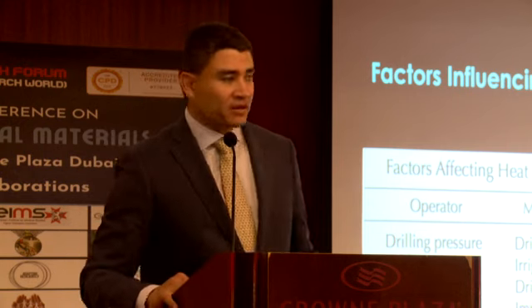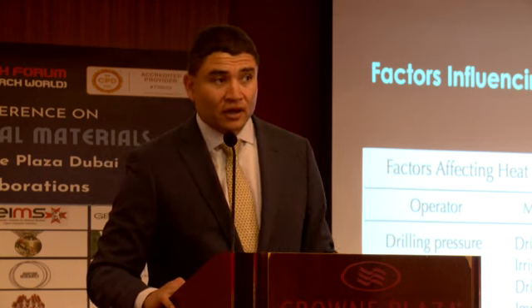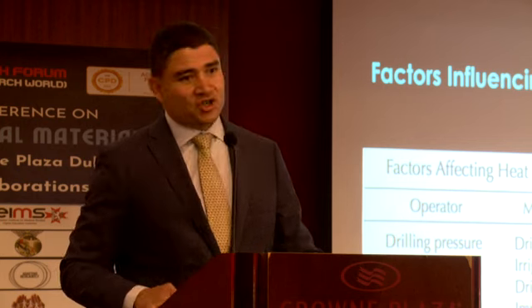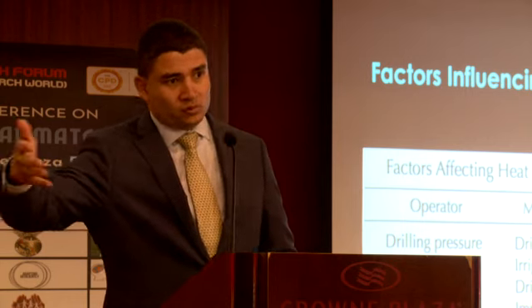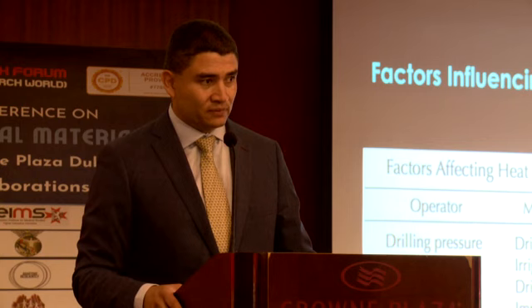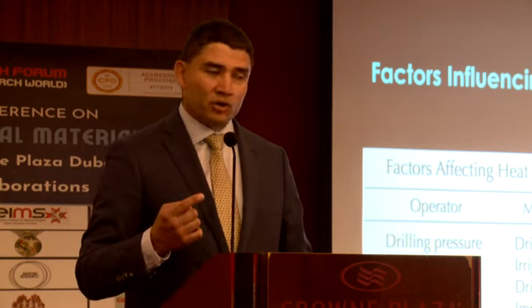The drill sharpness. Is my drill sharp or not? How many times have I used the drill? Oh, I'm a cheap dentist. I'm sorry, I haven't saved some money, right? I charge the patient an extra $2,000, $3,000, $4,000 an implant. But I'm going to save $100 on a drill. And I'm not going to change it.